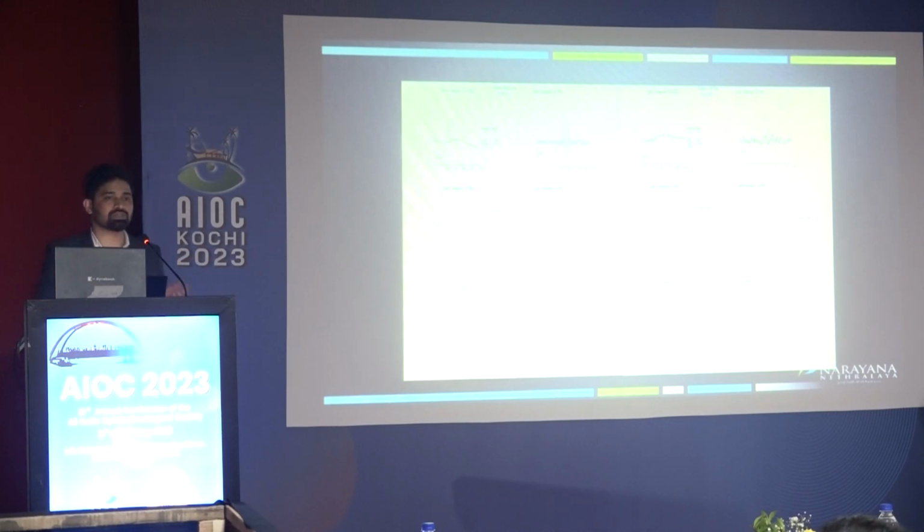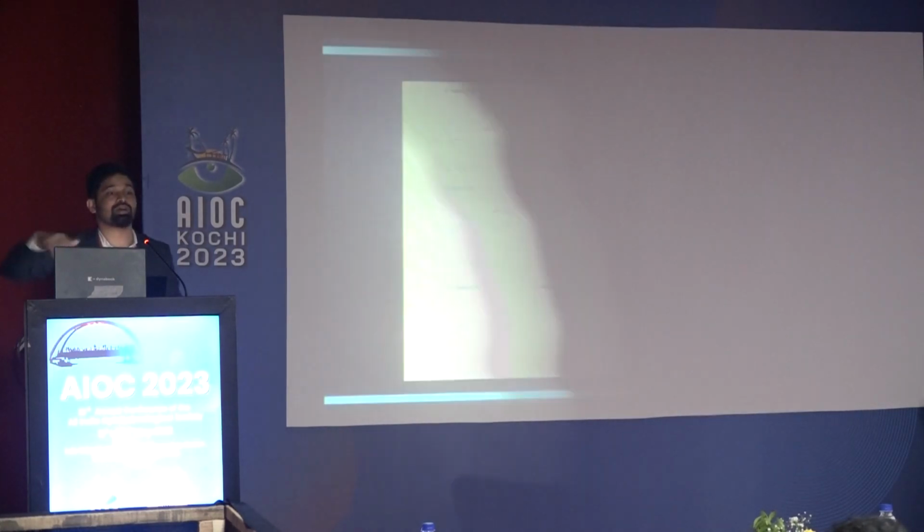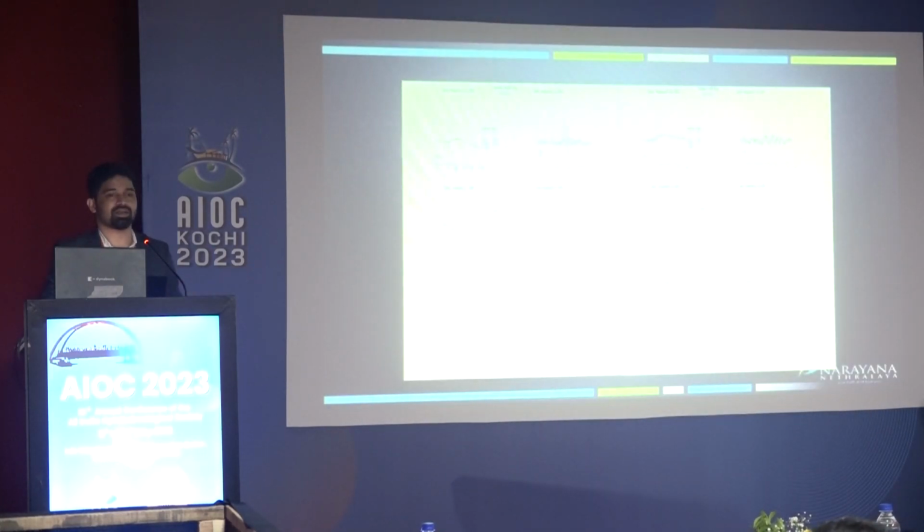So whenever you read an OCT, go in order, tell the findings, and say it could be suggestive of so and so. You should always give a differential. I saw you people doing this when sir showed an OCT, you suddenly said CSR. Don't do that. Whenever you are given an imaging entity or any investigation, go in order. That way you will have an advantage. You will take a lot of time to answer, so you can avoid unnecessary questions which you would not have read. And examiners will also be impressed when you go in a methodical order. So this has a cone rod dysfunction.